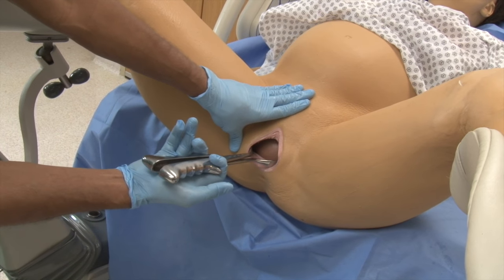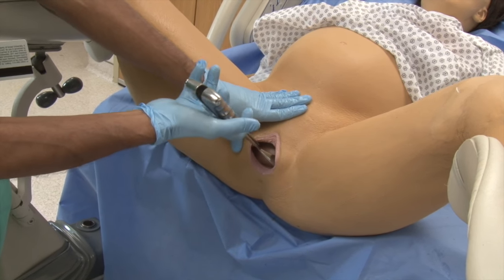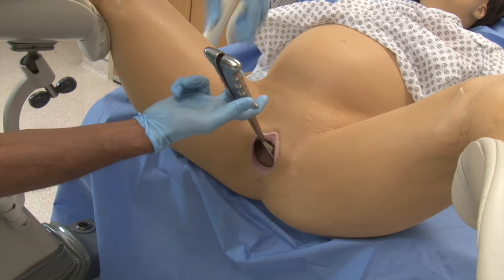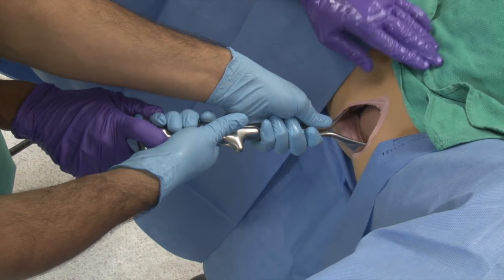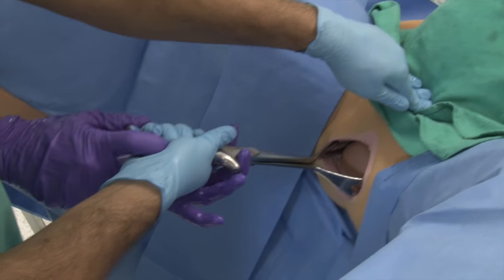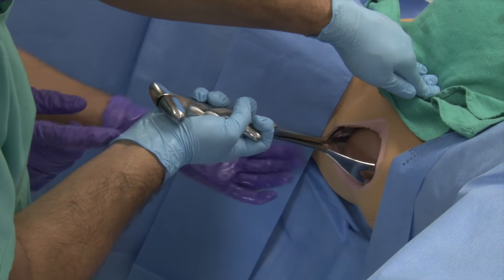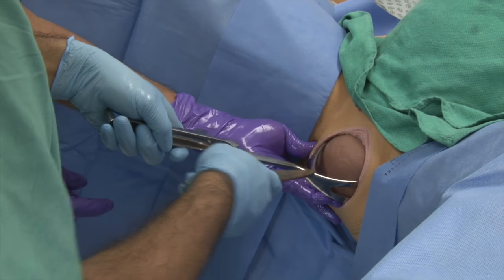Once the head starts coming up, you would raise your hand up and you'll be lifting it pretty much perpendicular to the table when the head is coming out. You can put one hand here or go on the bottom right here. This is where you would take off the forceps if you wanted to.